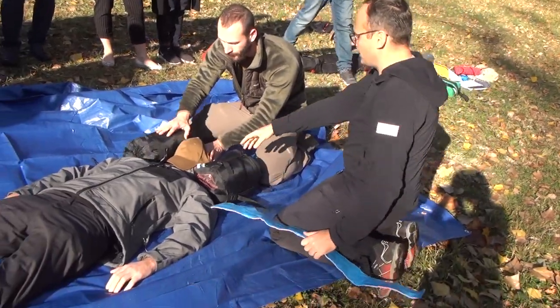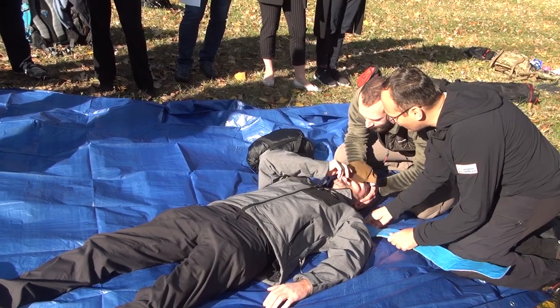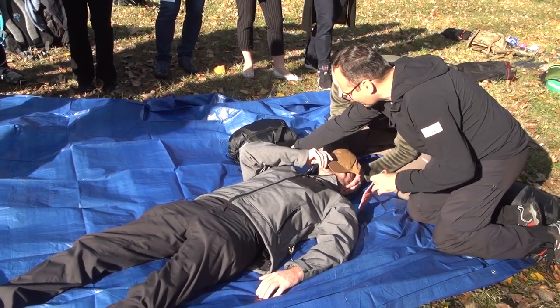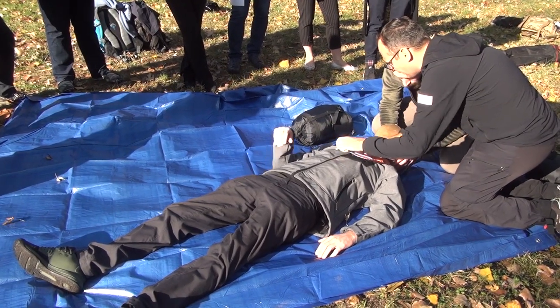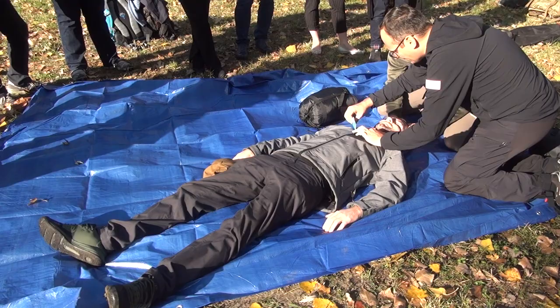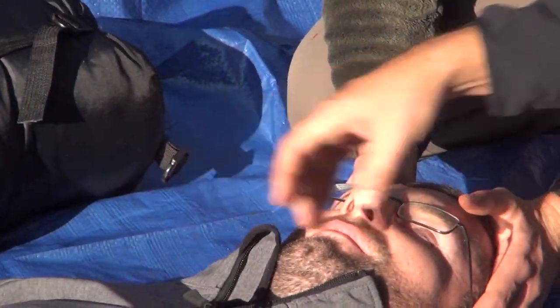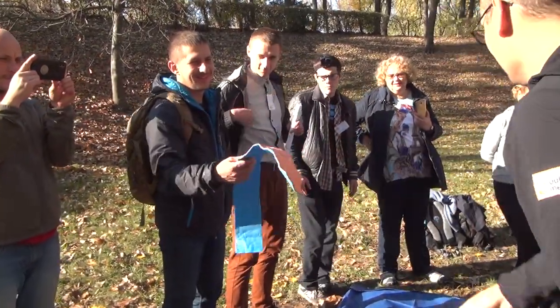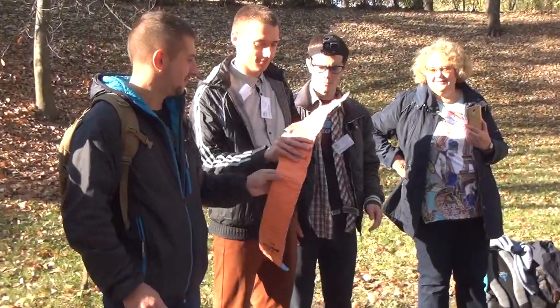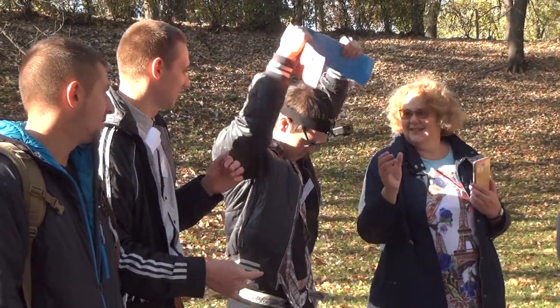So Kostya, can you take the head again? So we slide this behind the neck and we just fold it around like this and then like this. And we have a C collar. You can use it for other things as well. I will pass it around so you can have a few. There you go. I used one. It's very easy. You can cut it with scissors. So also, if you even have a broken finger, you can use it. So that we can do for the C-spine.